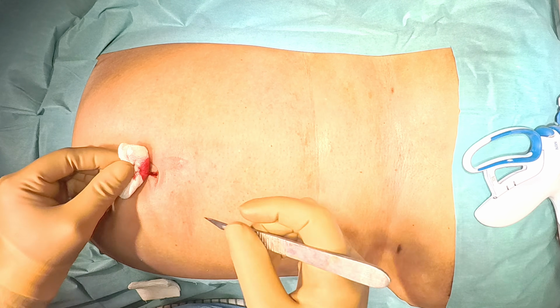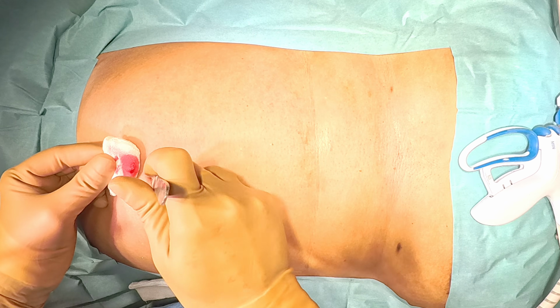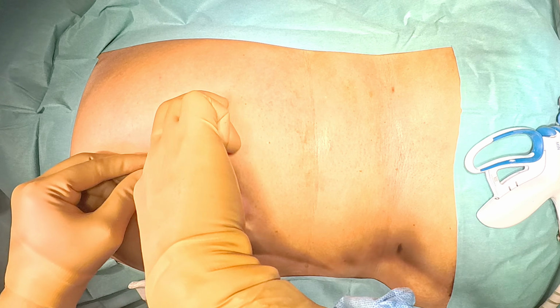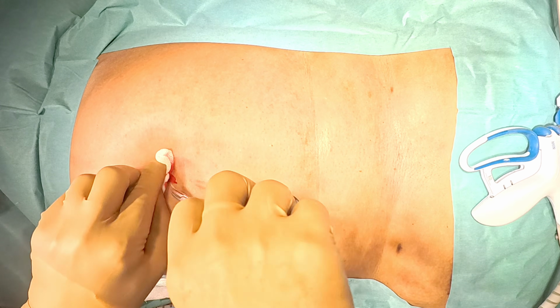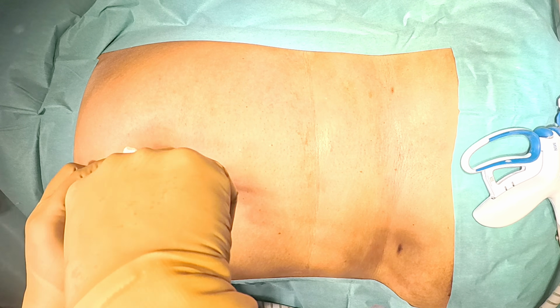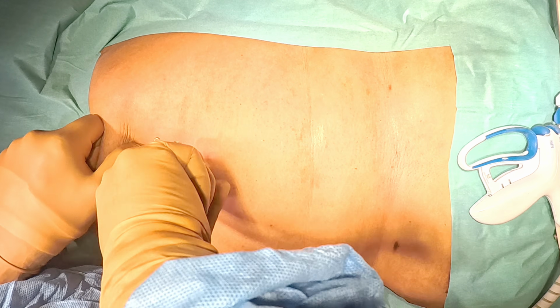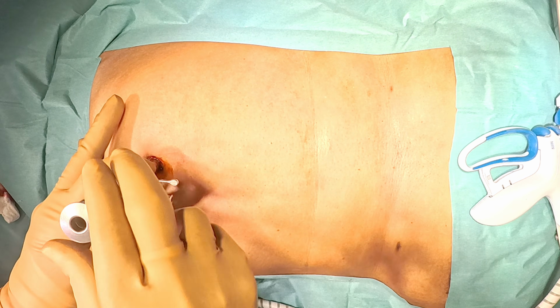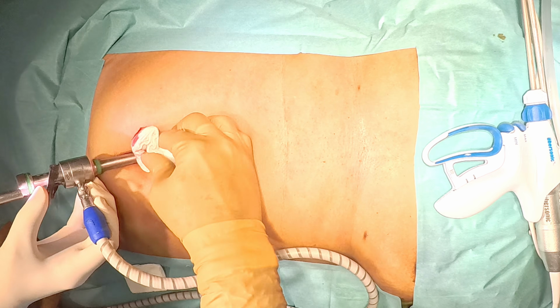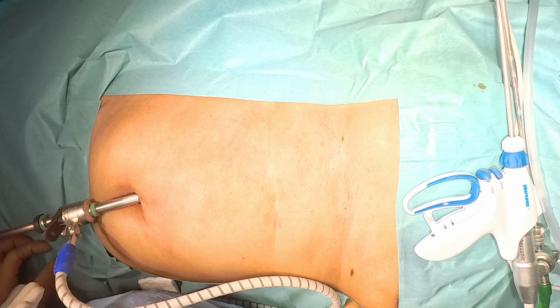So, pneumoperitoneum is done. Now, we will enlarge the incision to 11 mm, that is a smiling incision. Dilating the obliterated vitellointestinal tract, and then the 10 mm port will be introduced. So, now the telescope will be introduced, and now we will introduce the epigastric port, and that will be only 5 mm.